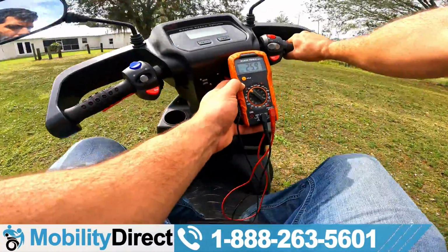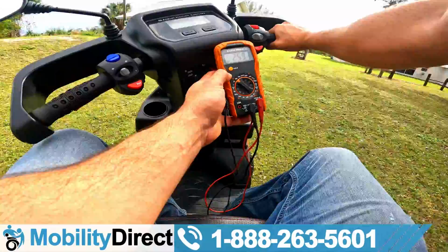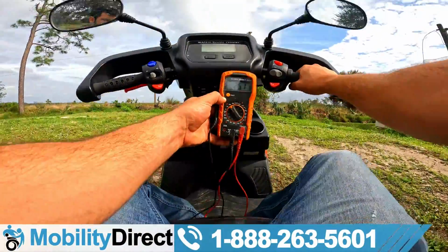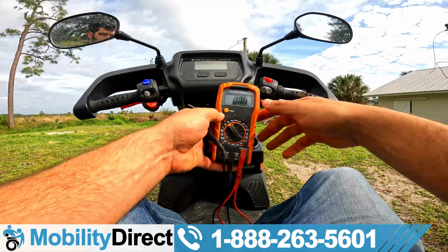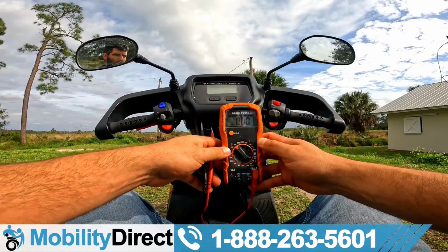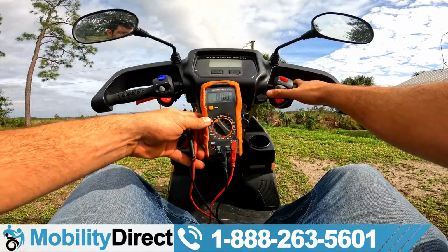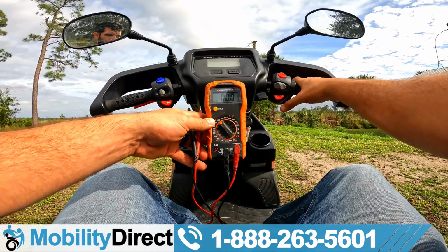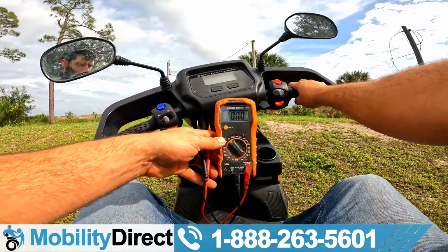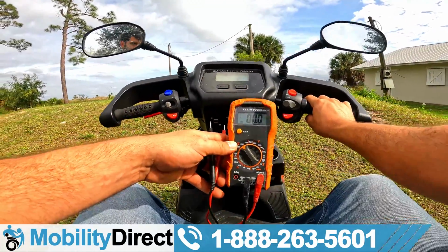So these batteries that I've had in here for a while now, they are lithium batteries, but I've had them for a long, there we go. It went to 24.8 and then it gave me the error 1 code. So it just shut off on me. And now it's actually working again, so it just temporarily shut off without even throwing the error code, which is strange. Let me actually do that one more time.